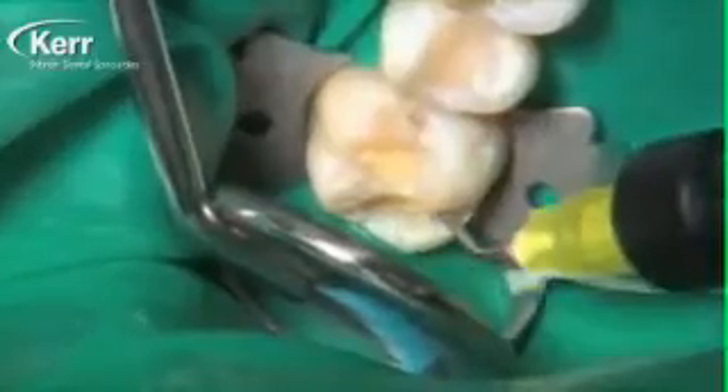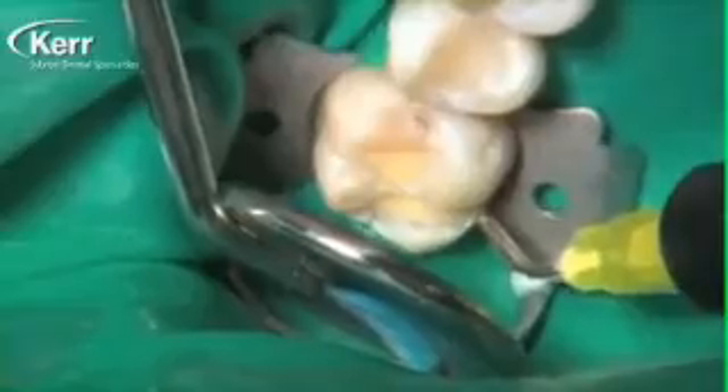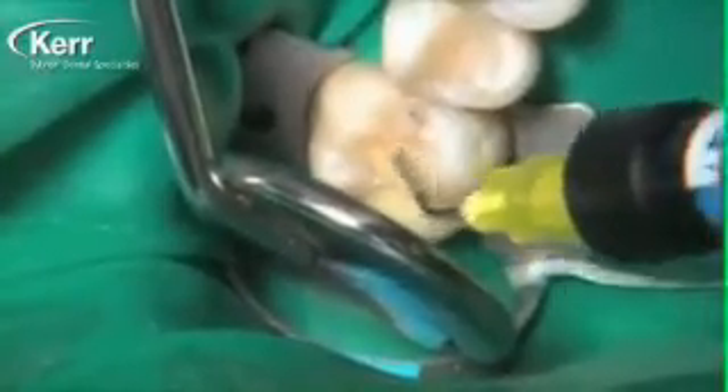We begin curing for 20 seconds because of the shade A2. As I look at these preparations now with that first layer of liner built in, I realize they're shallow enough that I can actually use the Dyad Flow as the entire restorative material. On larger composites I like to use something stronger like the Herculite Ultra we used on the tooth in front, but for these smaller restorations most dentists I talk to do use a flowable composite — and now you can use the same composite you used as a liner for your final restoration.